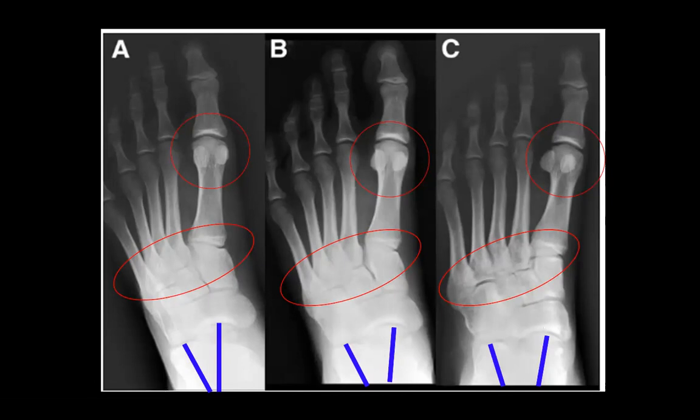Let's learn here that read the images that you have and go with the angles of what you have. But when we're actually taking them, you have to fully understand that sometimes our patients aren't fully weight bearing, or they're not in a good position, and that may not give us the best radiographic angles.